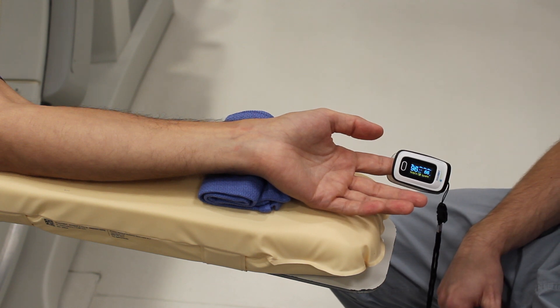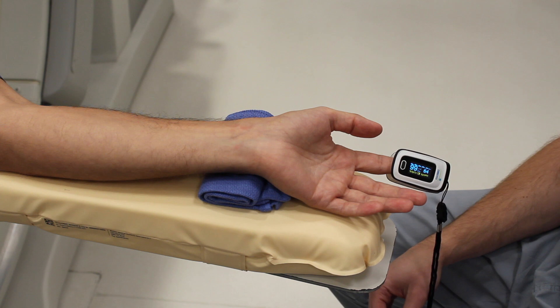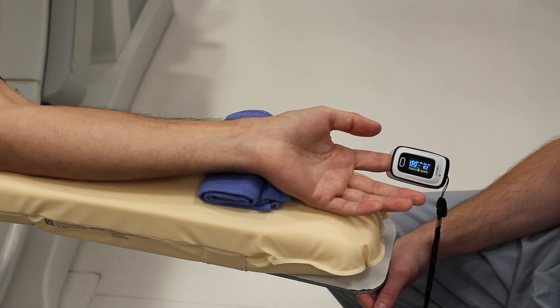Hey guys, this is Chris Beck with the Backtable Lab and I'm going to show you how to do the Barbeau test. If you're ready to take on some radial cases, one of the clinical backbones to know about your patient's circulation of the hand is the Barbeau test.